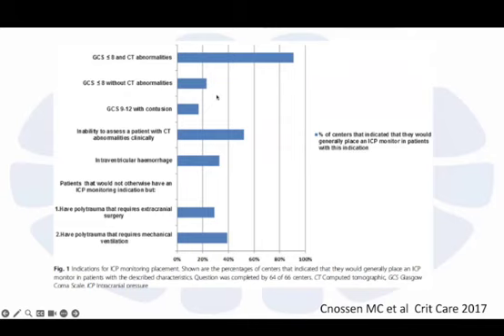But there are some centers where, for example, with a poor neurological status, so below 9, but also without CT abnormalities, they will put an ICP monitoring. Or they will put an ICP monitoring in patients with a moderate TBI, so GCS from 9 to 12, but with contusions which can evolve and can potentially cause neuroworsening.